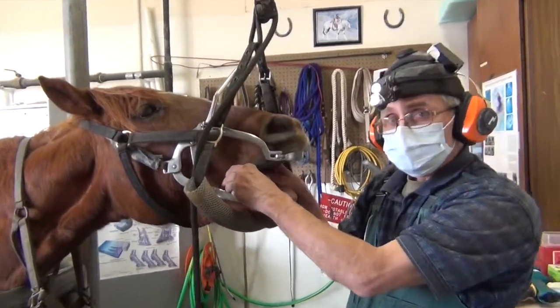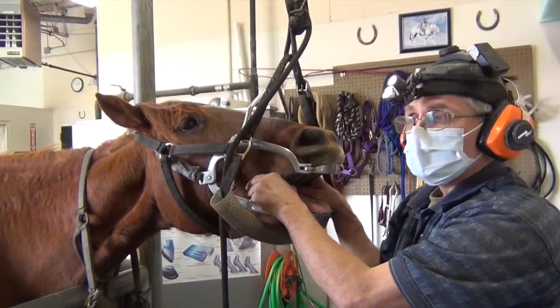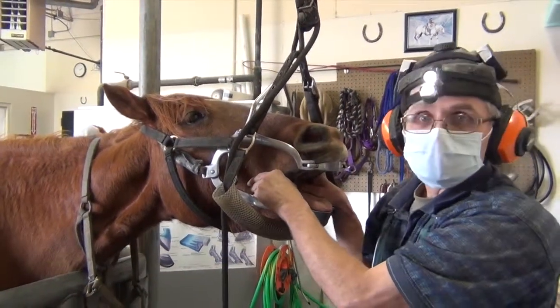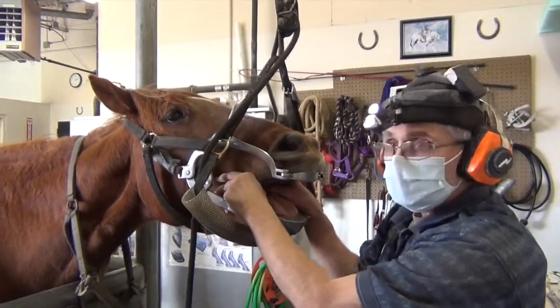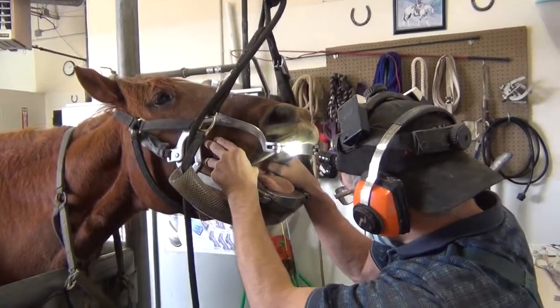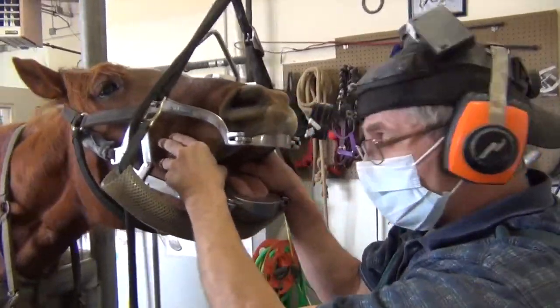She's been a really good patient. Not all of them are. But what makes her a good patient is she stays pretty still, and during the process she really doesn't fight much. She's not moving her tongue around, and she's really pretty cooperative.